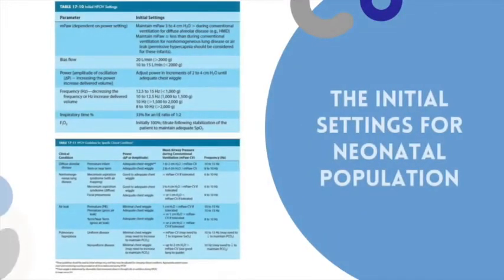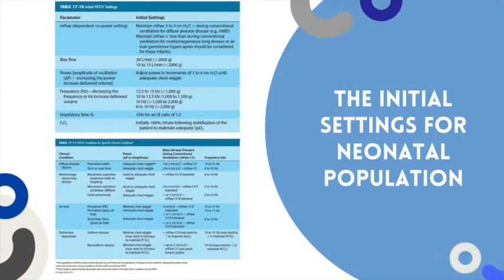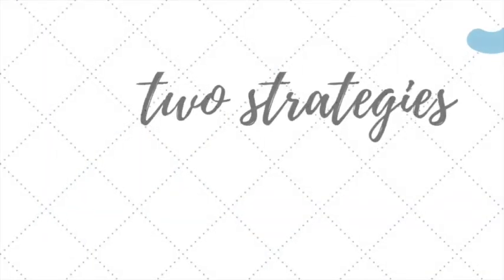Shahad, what are the initial settings for the neonatal population? Can you follow the tables? It will guide you. And there are two strategies you can follow depending on the patient condition.